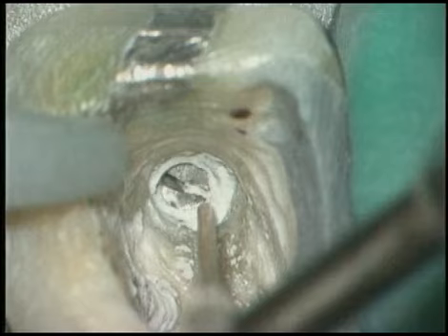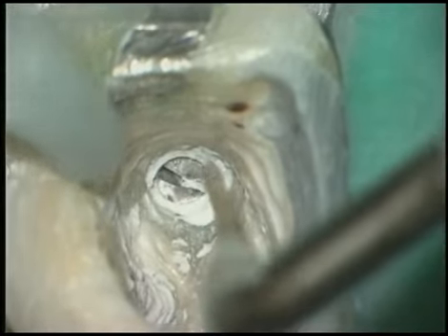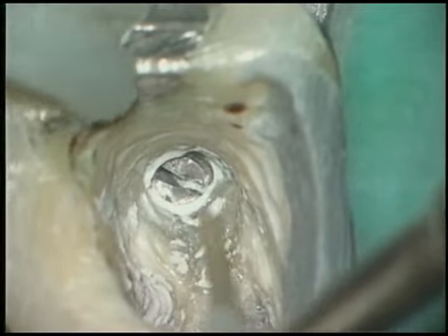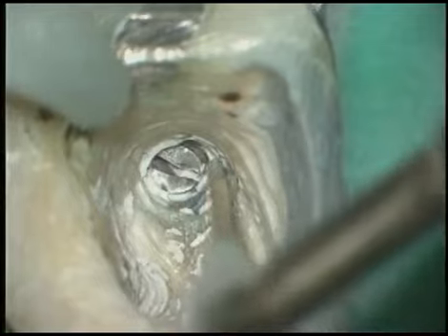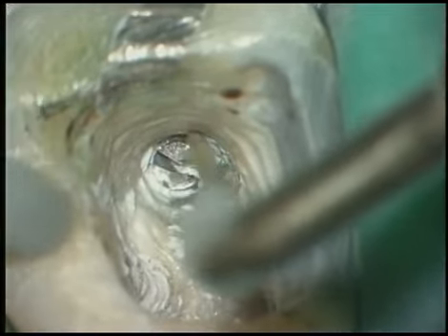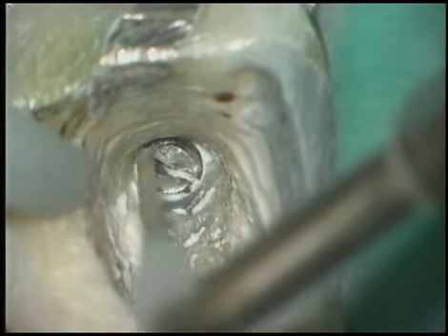Well, the post just sheared off and is broken for a second time. You can see then that we need to really be resilient to these setbacks and again have a fallback position. Fortunately, with the microscope and at high power, I'm looking to about mid-root in the canal.